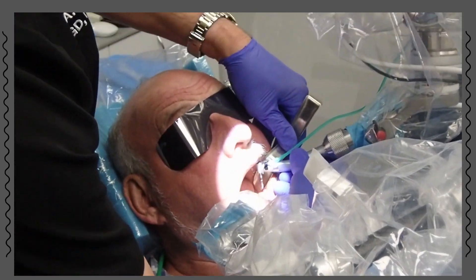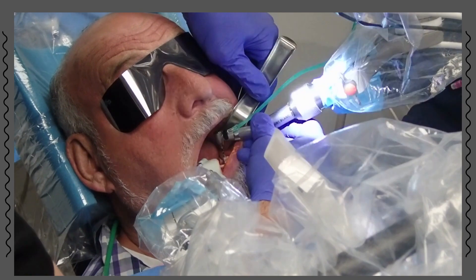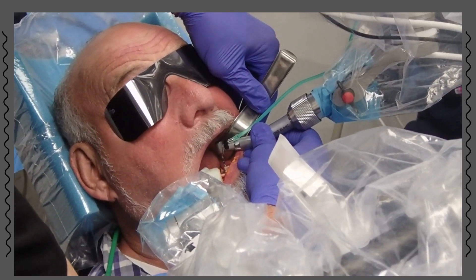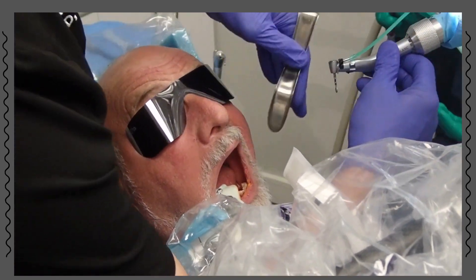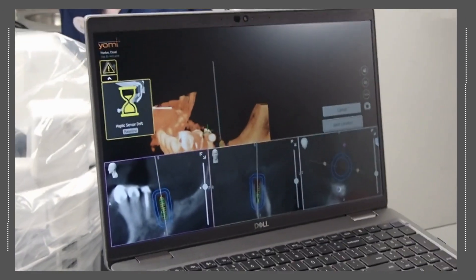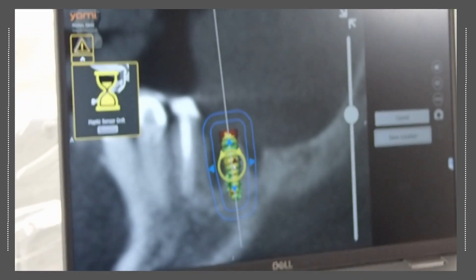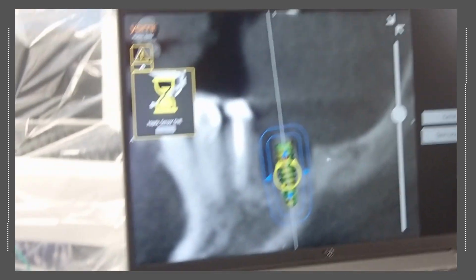So now we have a sequence: place implant at a tip. Drill here, drill here. Loading. Good. So this is where we have our implants, septal bone, and everything looks awesome.